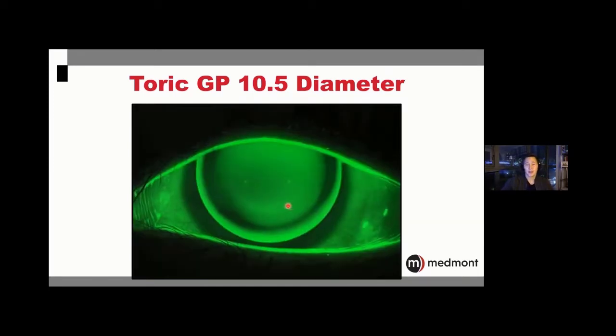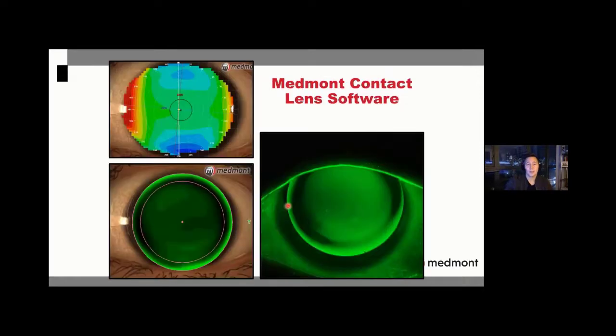So you hopefully get the sense of how valuable this tool can be in assisting us with our specialty contact lenses. For instance, our baseline topographies, or our pre-fitting topographies, told us that our previous contact lens might be on the flat side. Our tangential map said that we can see the rings of where the lens lands, and it's definitely high. The elevation map is telling us that we have a relatively toric peripheral cornea. Our contact lens software is telling us where to begin and also pushing us to modify the parameters so that we have less fluid running through the vertical.